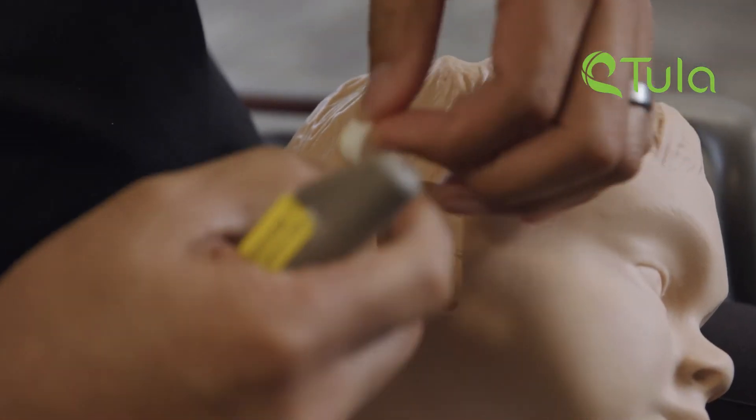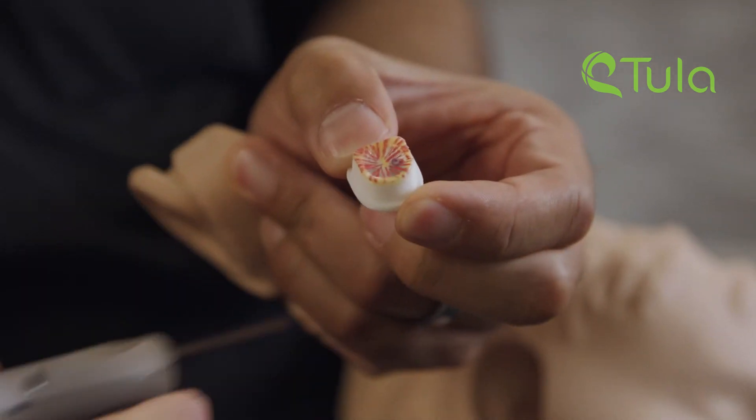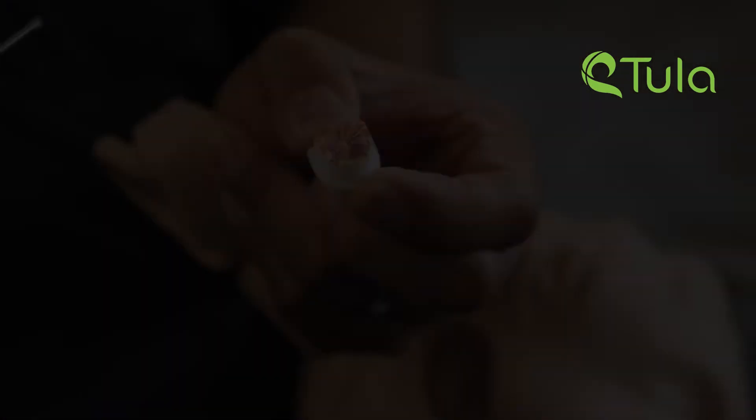That's it. All done. This training model has in it a simulated eardrum, and there you can see the tube right in the simulated eardrum.